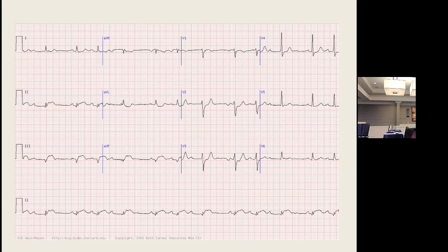You might say, how do I know that? Well, look at the lead above where I can clearly see the T wave. Drop your line down. You can see that's your T wave, and you can see your ST segment is elevated. Now, it's not 6 millimeters, but it's 3 millimeters of elevation. And it's elevated enough in two or more contiguous leads, 2, 3, AVF, Q waves forming. This is exactly what happens with an MI in evolution.